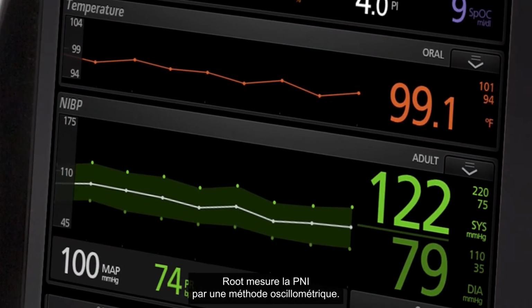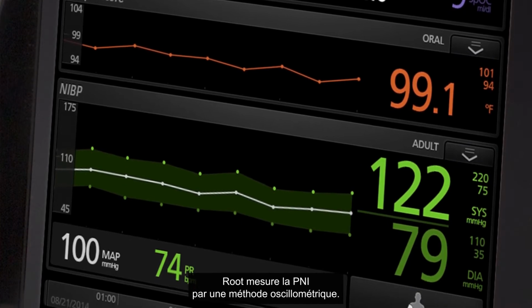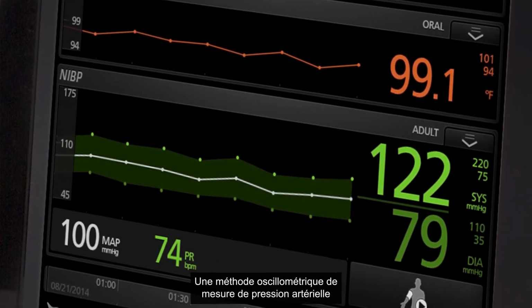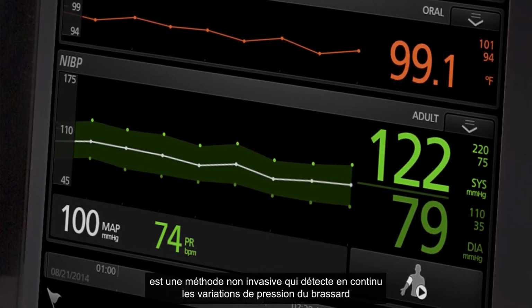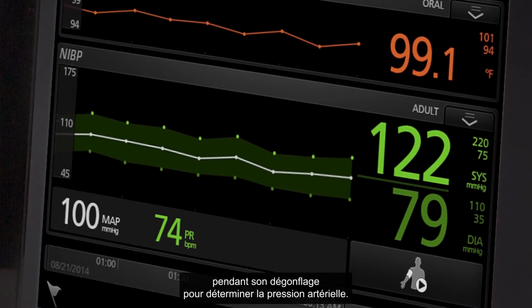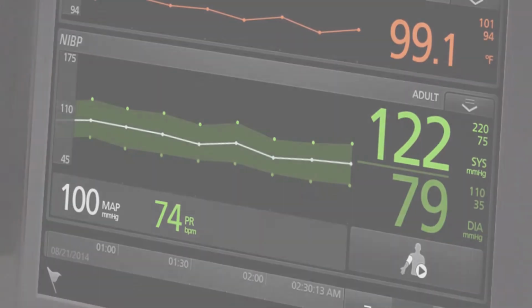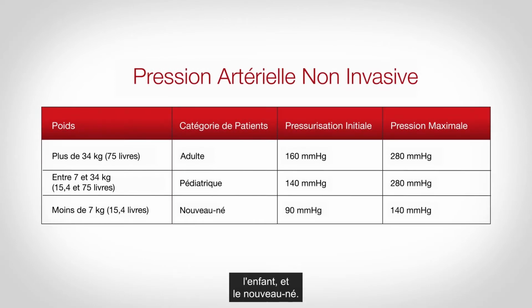Root provides non-invasive blood pressure readings through an oscillometric method. An oscillometric method of blood pressure measurement is a non-invasive method that monitors the amplitude of cuff pressure changes during cuff deflation to determine arterial blood pressure. The non-invasive blood pressure module is designed for use on adult, pediatric, and neonatal patients.